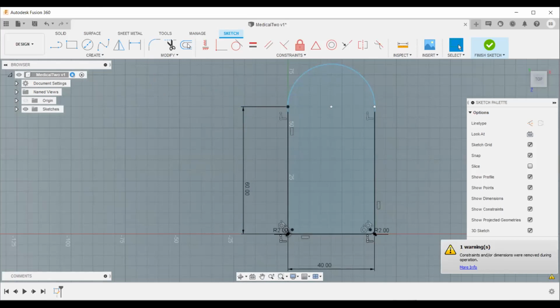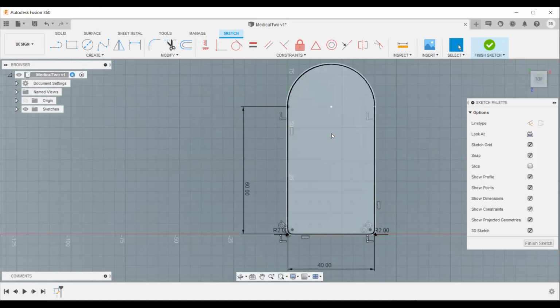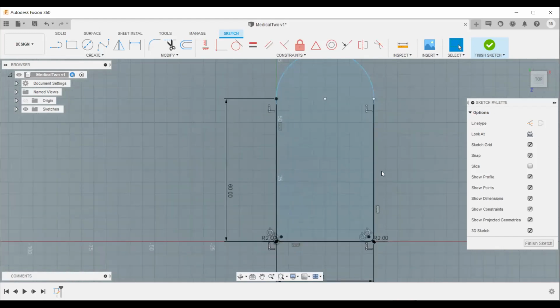Then you can do what is called offset, although we are not going to use it here. When you click offset, it is going to draw a similar shape which is parallel to it with that offset value. Like if you do offset 2, you are going to draw the exact shape inside, but with 2 millimeters between them. So I'm not going to do it right now. Is everyone there? Yeah. Everyone, are you there?